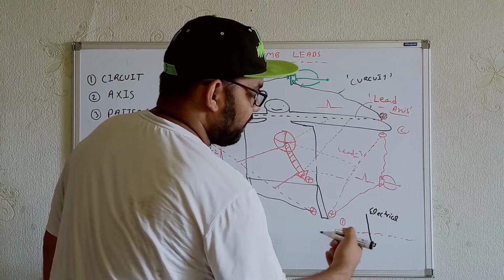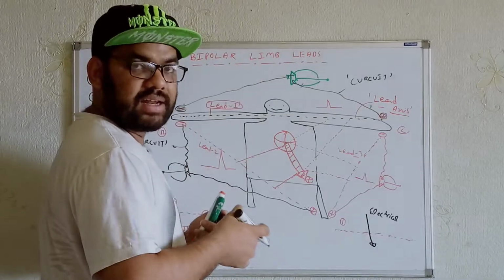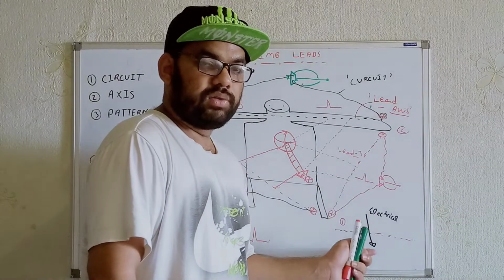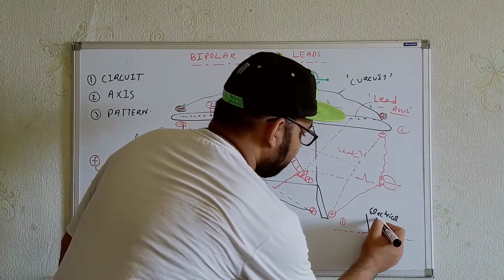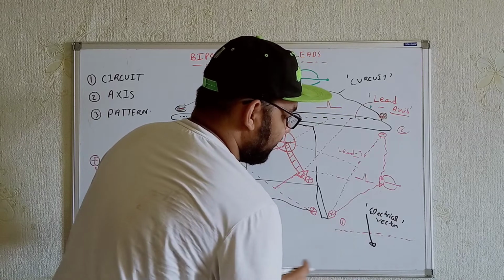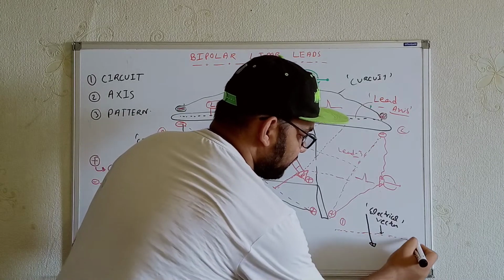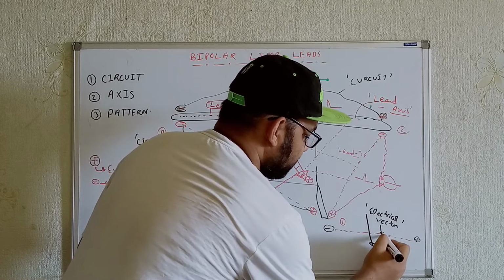As a result, whatever deflections we will see over here, we will see the positive deflections as well as the negative deflection. Let me repeat once again: whenever an electrical vector goes perpendicular with respect to the lead axis, for example, if I divide this part, it is coming towards the lead axis. After that, it is going away from the lead axis.